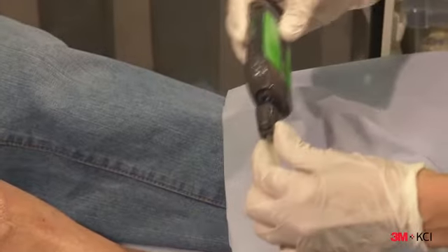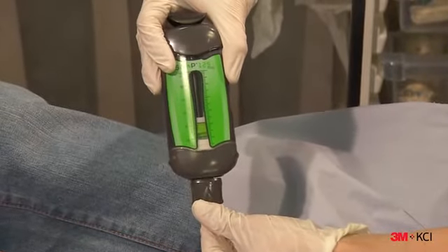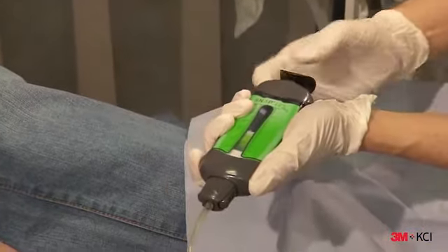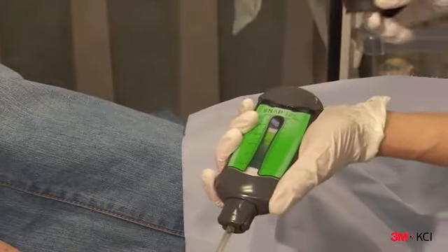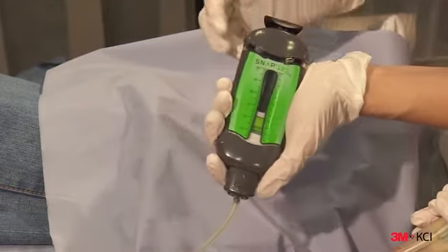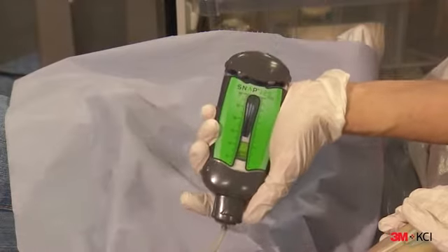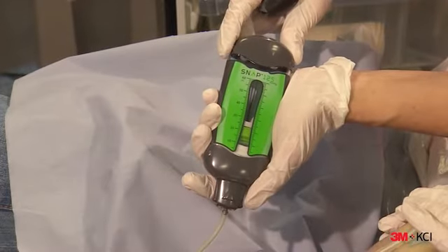Connect the Snap Therapy cartridge to the tube fitting using both hands. To activate the cartridge, press down on the activation key and pull it out. Reinsert and repeat as needed until an airtight seal is obtained and the red pressure discharge indicator is not visible in the pressure discharge window.